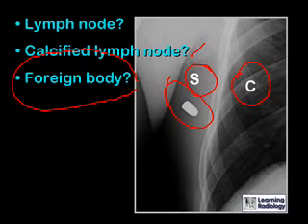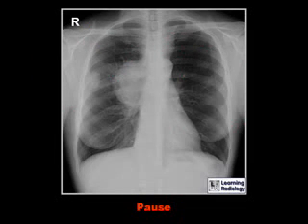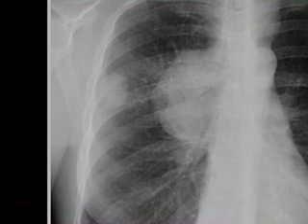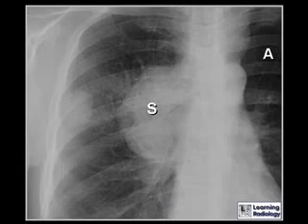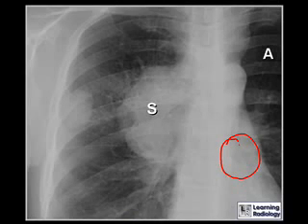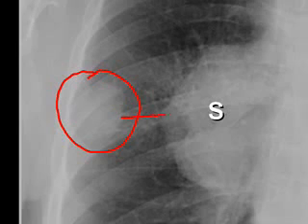If you correctly identified this as a foreign body you'd be correct, and if you identified it as a bullet you'd be even more correct — so this is metal density. Here's another abnormality in the right paratracheal region. It is soft tissue density, the same density as the heart, and denser than the air in the lungs. It's adenopathy in the right paratracheal region, and there is also a mass in the lung representing the bronchogenic carcinoma that metastasized to the regional lymph nodes.